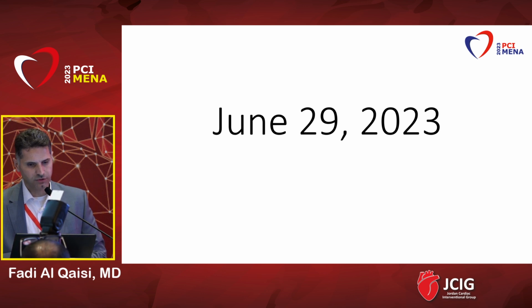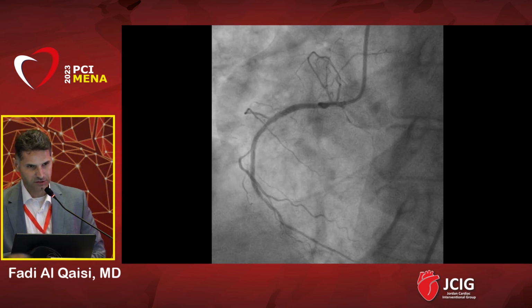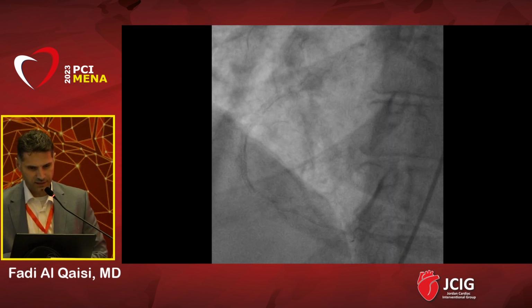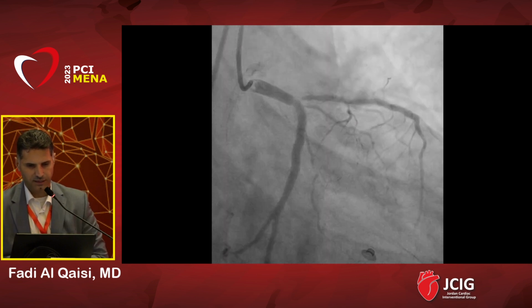Now let's move on to June 29. Obviously, you have noticed that this was during Eid holiday, so I was with my family in Turkey. My partner, Dr. Ramzi, took her to the cath lab. This is her RCA. And this is her new distal left main, proximal left circ, proximal LAD.